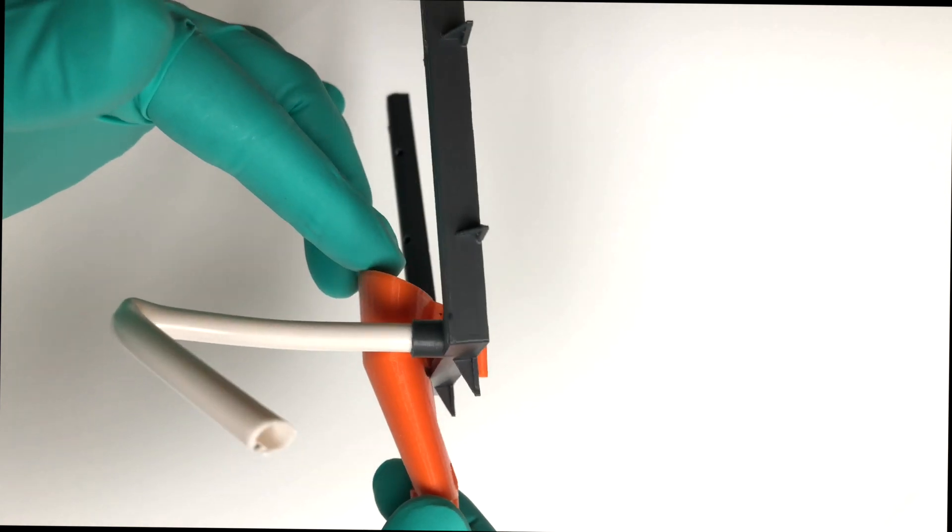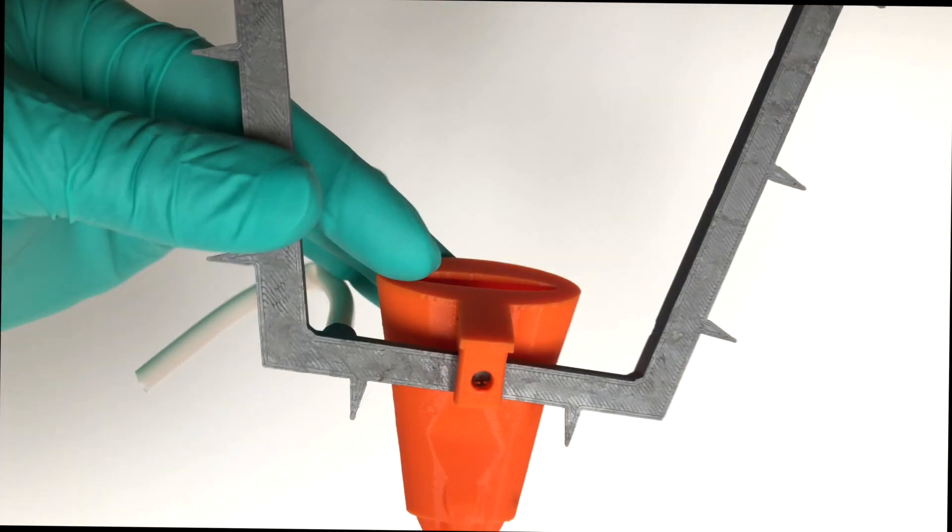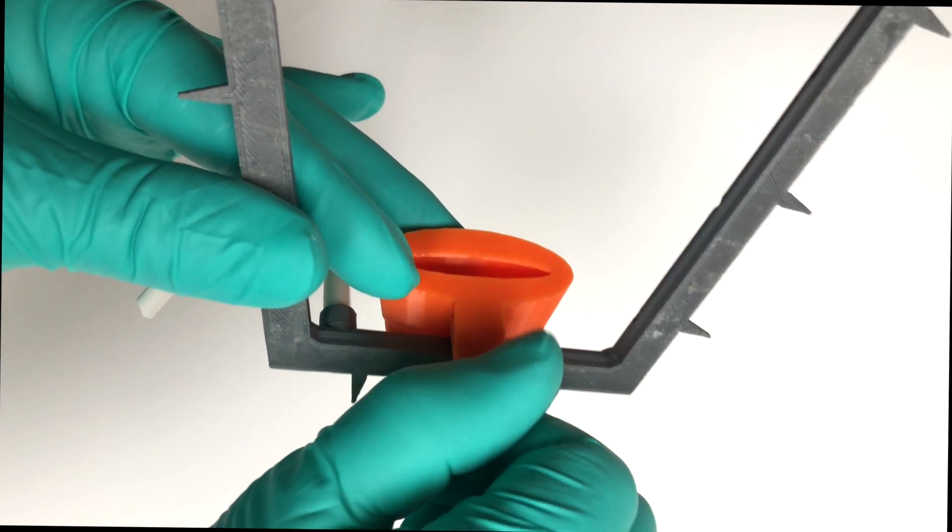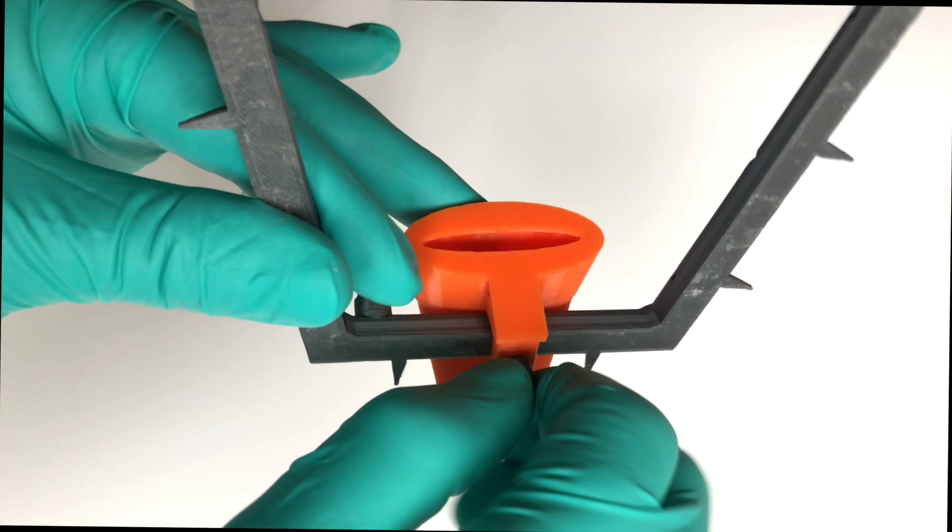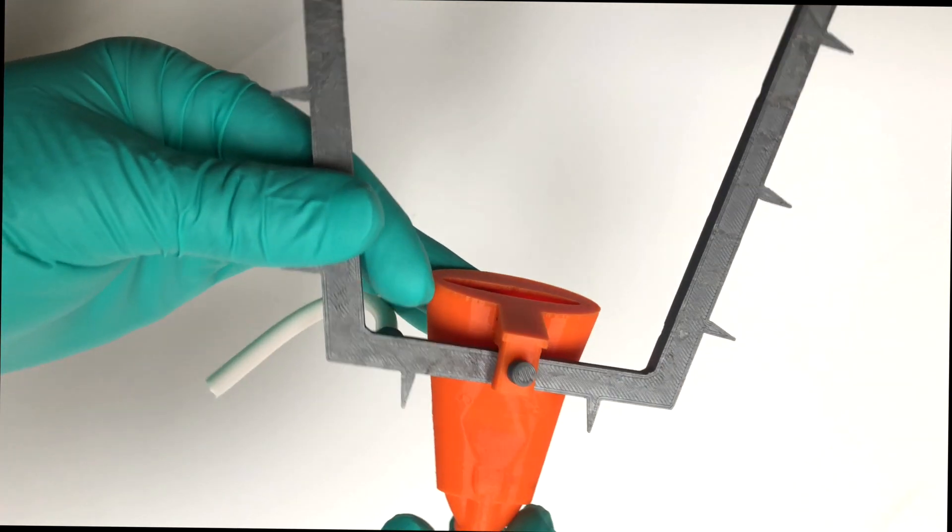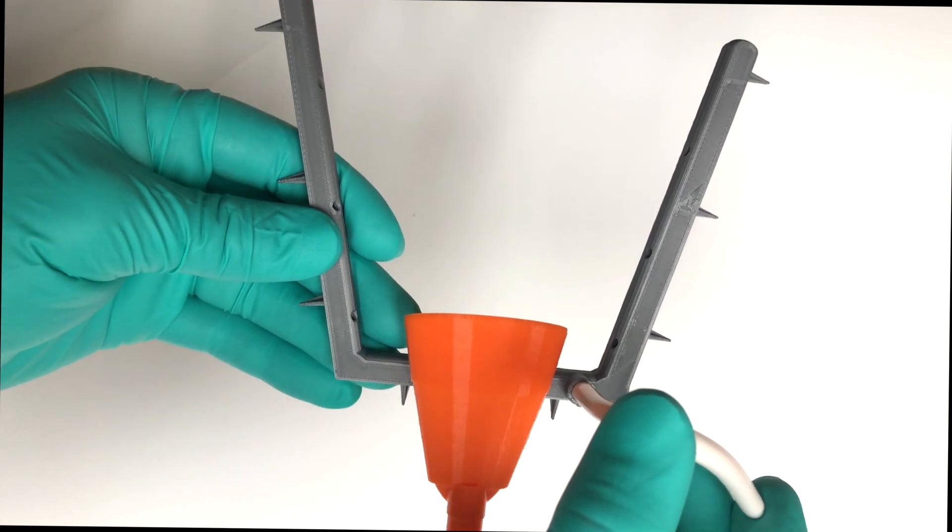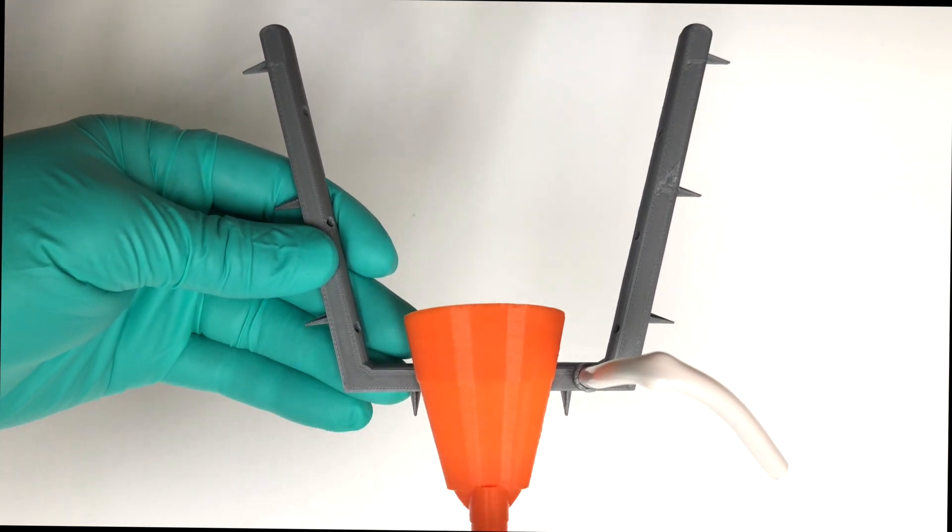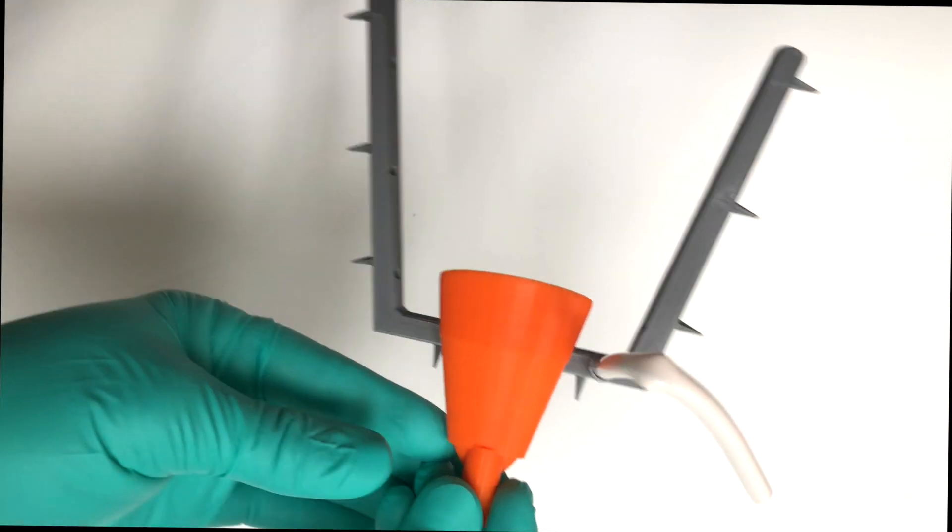And then lastly, what you need to do is you need to secure that with the retention bolt, which is also 3D printed and tighten that finger tight, as tight as you could get it. And that's going to stabilize the whole thing together. And of course that hooks up to your saliva ejector there. And the high volume there is going to hook up to your high volume suction unit.